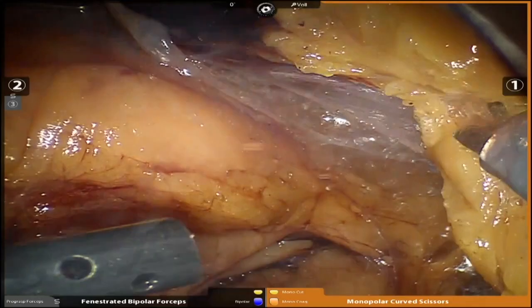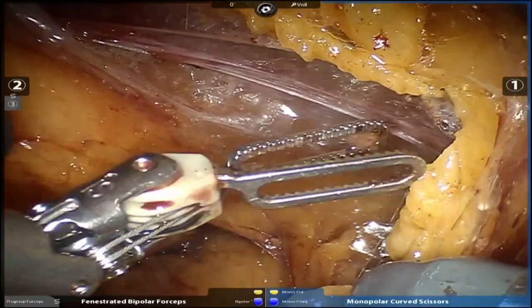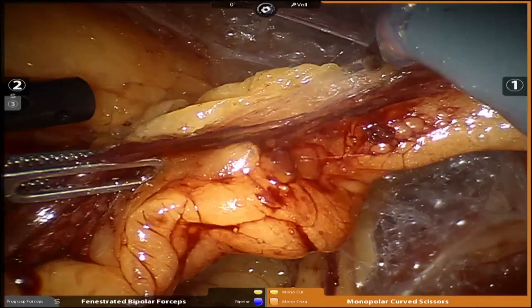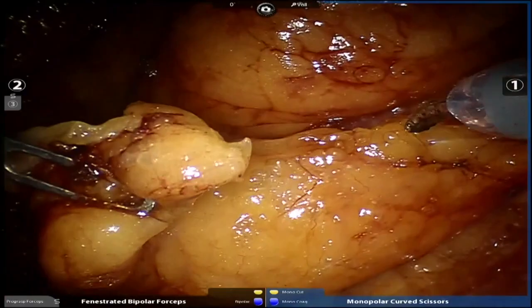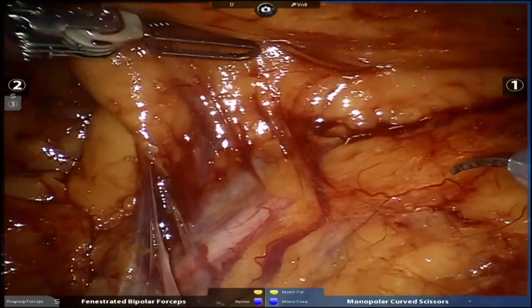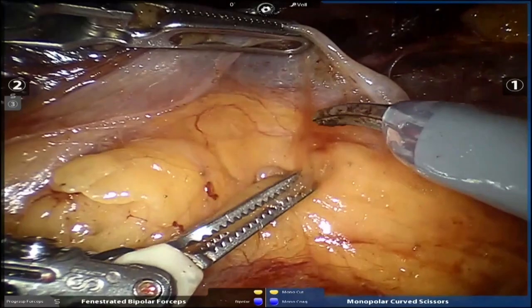Professor Porter, in the meantime, I would like to ask you if you are planning to control the vein as well in order to prevent any backwards bleeding during the approach into the tumor, or are you just controlling the artery? That's a really good question. I mean, like I said, 90% of the time, I only do the artery. Retroperitoneally, I found it not necessary to control the vein, but this tumor is very central. And there's a very large venous branch. So now we have perfect visibility. There's a very large venous branch going into the tumor as well at the base. So we'll probably control the vein as well.